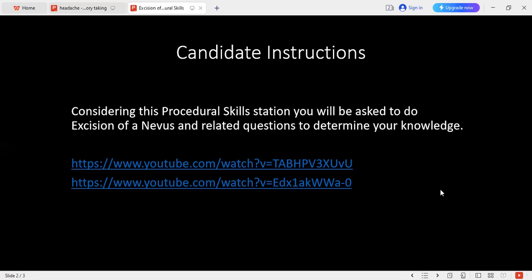Why would you prefer interrupted sutures? I will use interrupted sutures because if there is an infection in the wound, with redness or any infection, then only that particular suture can be removed. If we use a continuous suture, the whole wound is open if we need to remove the suture in future. Okay. Please continue. What would you do next?